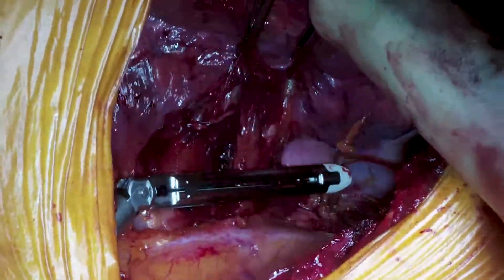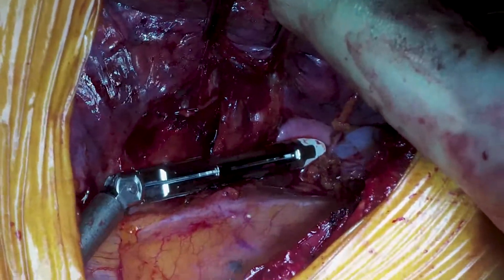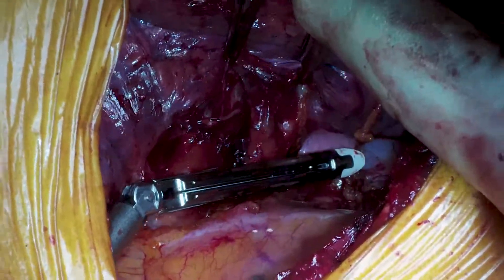Using the anterior port made earlier and the 8mm stapler again, we're stapling off the truncal branch of the pulmonary artery.